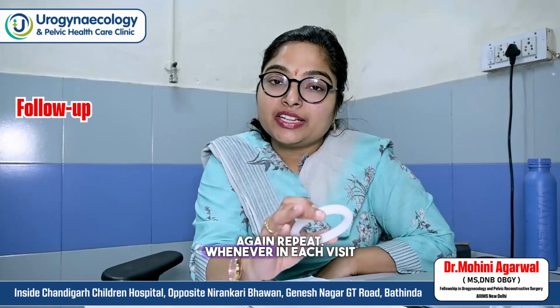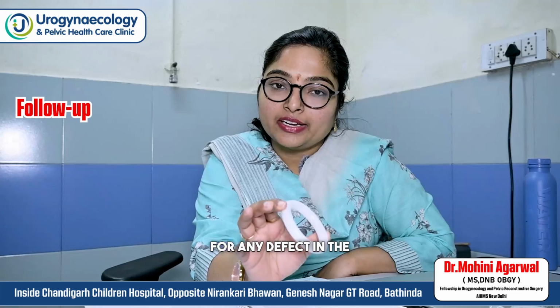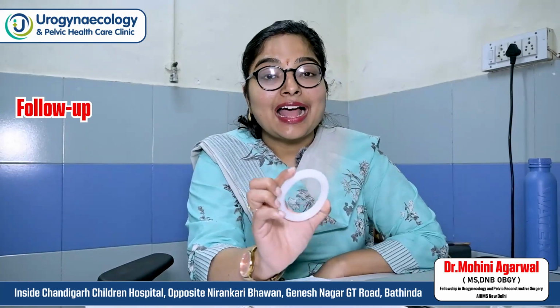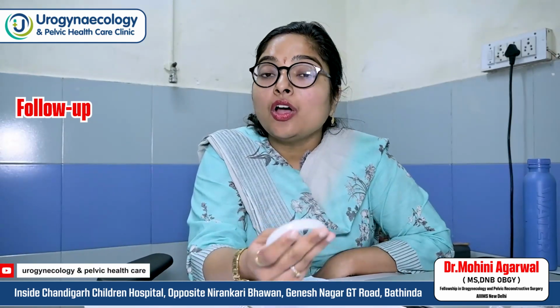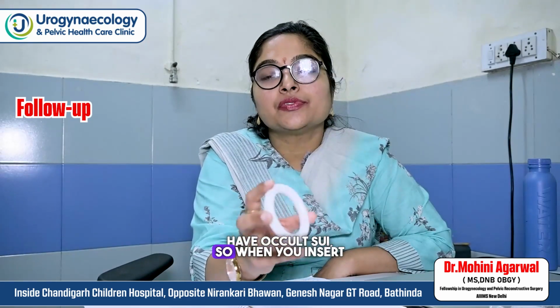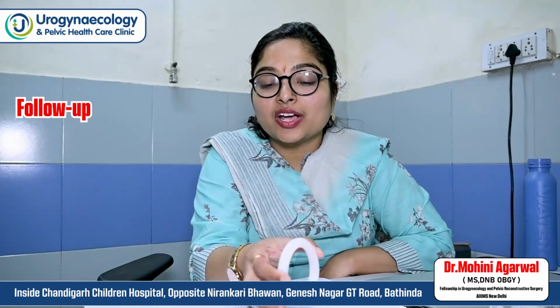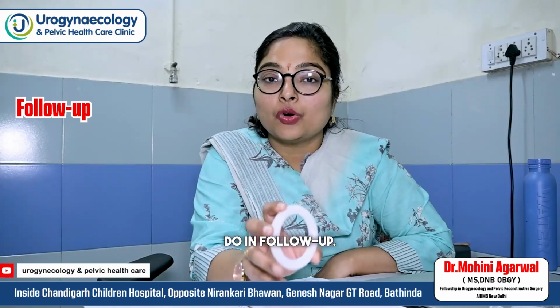Again, repeat. In each follow-up visit, what are you going to do? You remove the pessary, you check the pessary for any defect, you check the vaginal wall for any erosion, pressure, ulcers, and you wash it and replace it. And you ask the symptoms of the patient, how much relief she is having, and whether there is a development of new symptoms. She might have occult SUI, which was not evident before insertion of pessary, and now she is having SUI. So you ask for the old symptoms, and for any development of new symptoms. So this is a follow up.